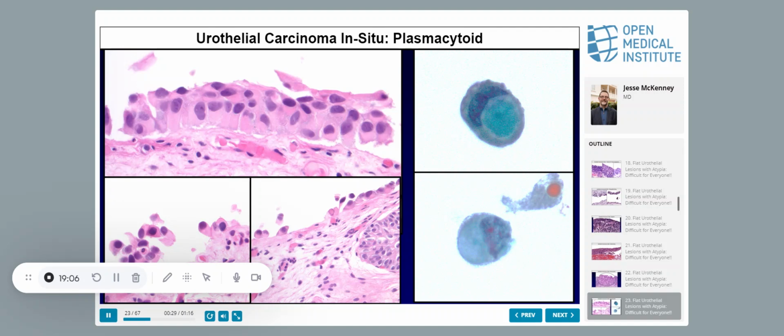That's okay. And I don't do cytology, but one of my colleagues, when we described this, she wanted to see what the cytology correlate was. So she went back and looked at the urine for all these. And you do see the plasmacytoid cells, but apparently, and again, I don't know this because I can't quote all the rules and criteria, by the Paris criteria, they don't reach the threshold for CIS. So in cytology, these would almost always be atypical.